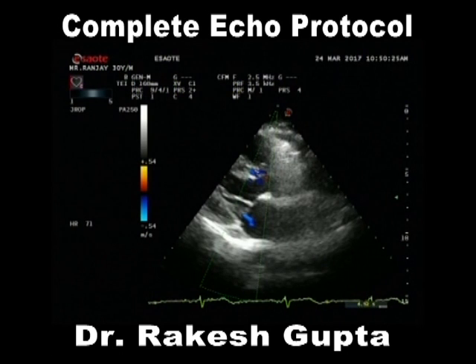If I am seeing something while perpendicular, it means it is much more when it becomes parallel. In the same view you will be able to see your flow across the mitral valve. If there is a stenotic lesion, you will be able to see it.